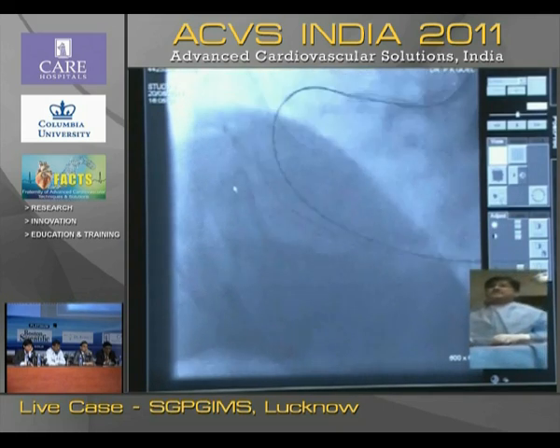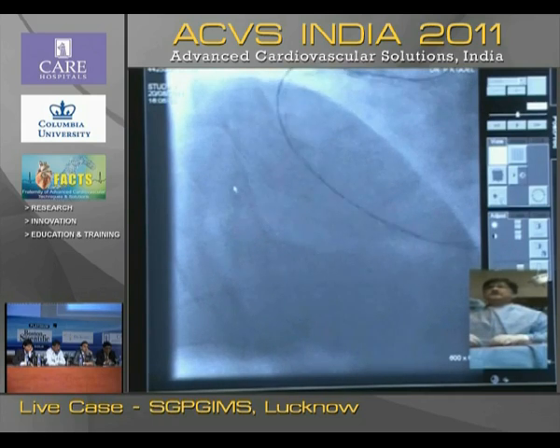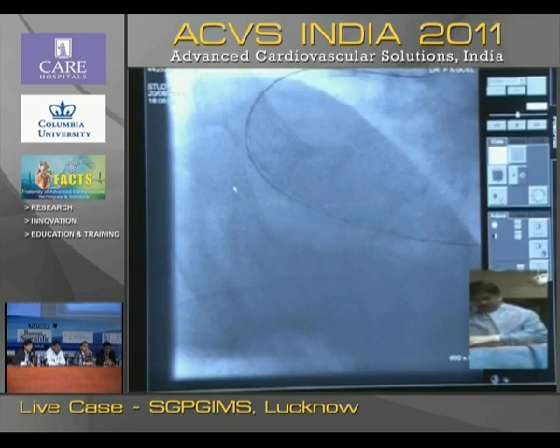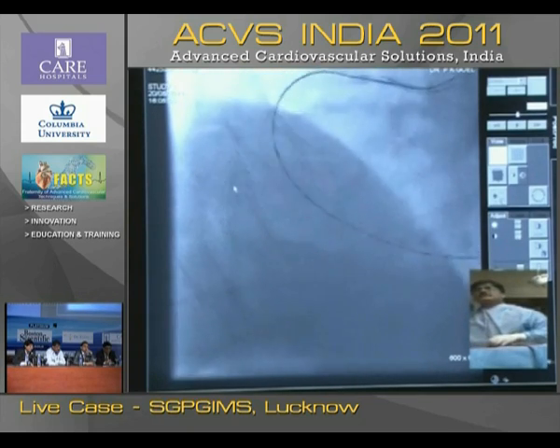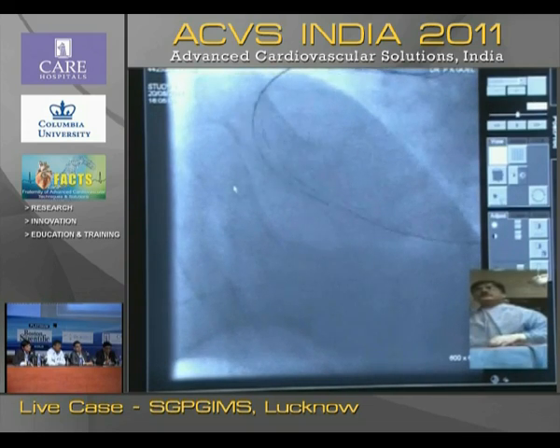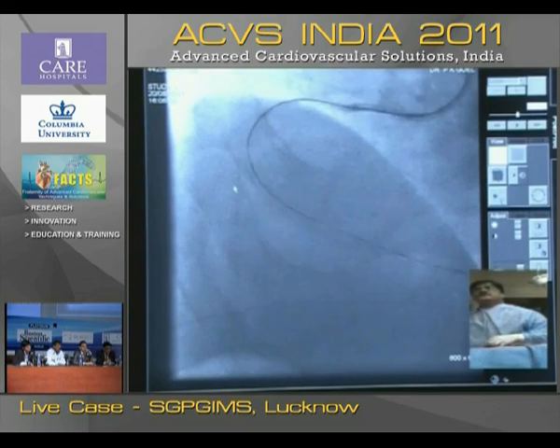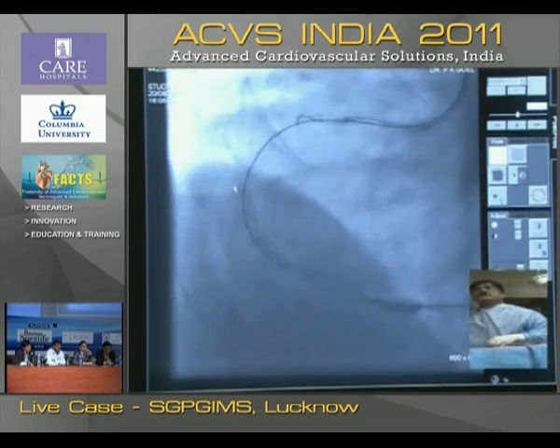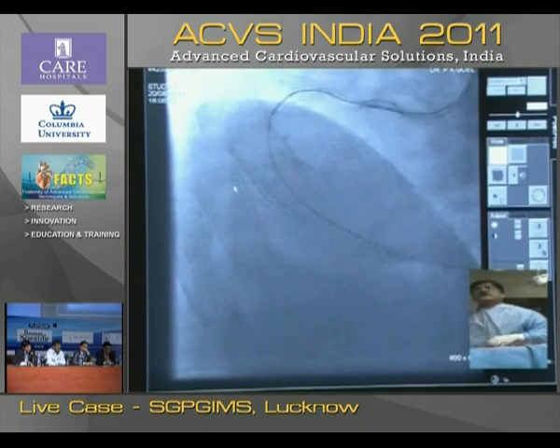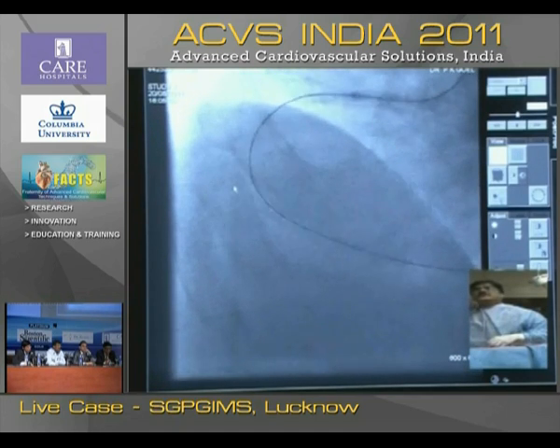Torquer, please. No, this is going the wrong way. There is some disease proximally also. Yeah, you need a long stem. I can use a microcatheter, I know. Give me a microcatheter, please. Let the microcatheter in to exchange.